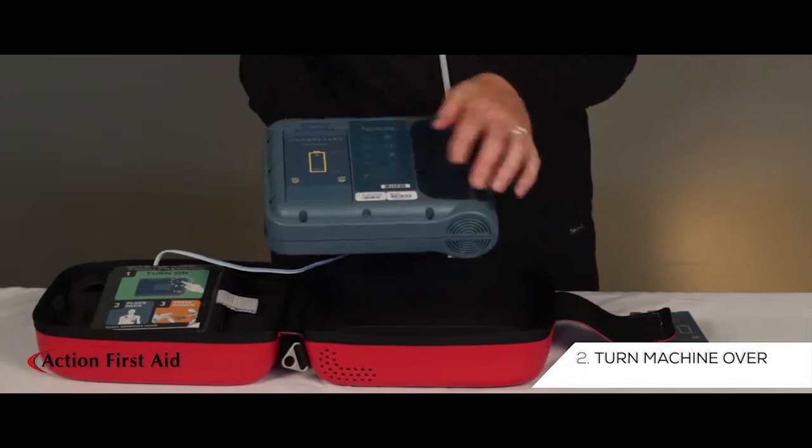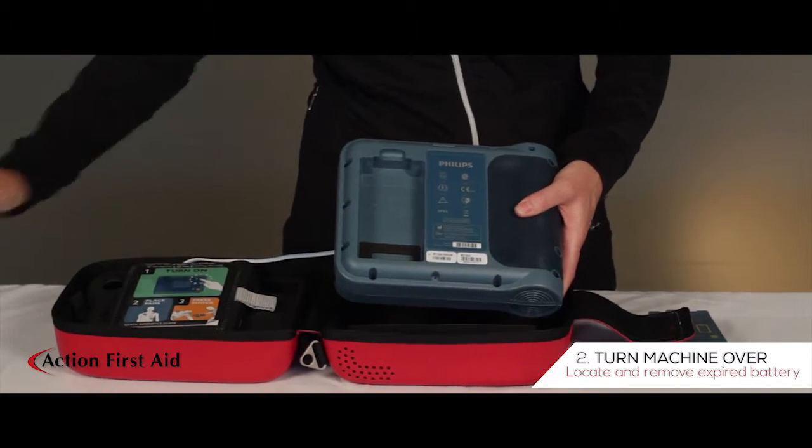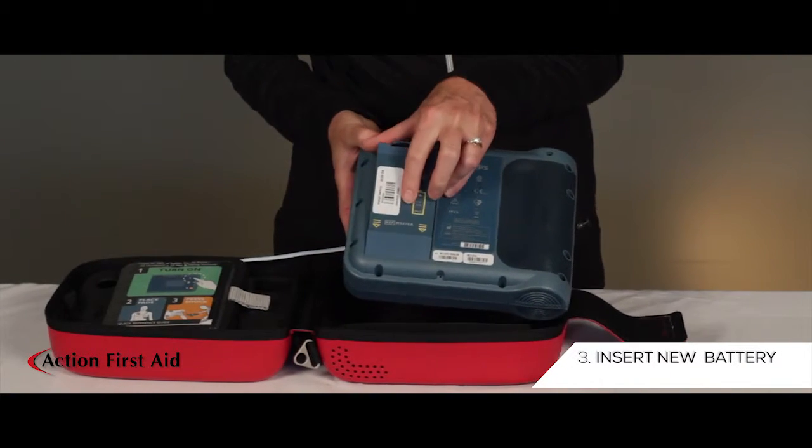Turn the machine over and remove the expired battery and set aside. Replace the battery and turn the machine over.